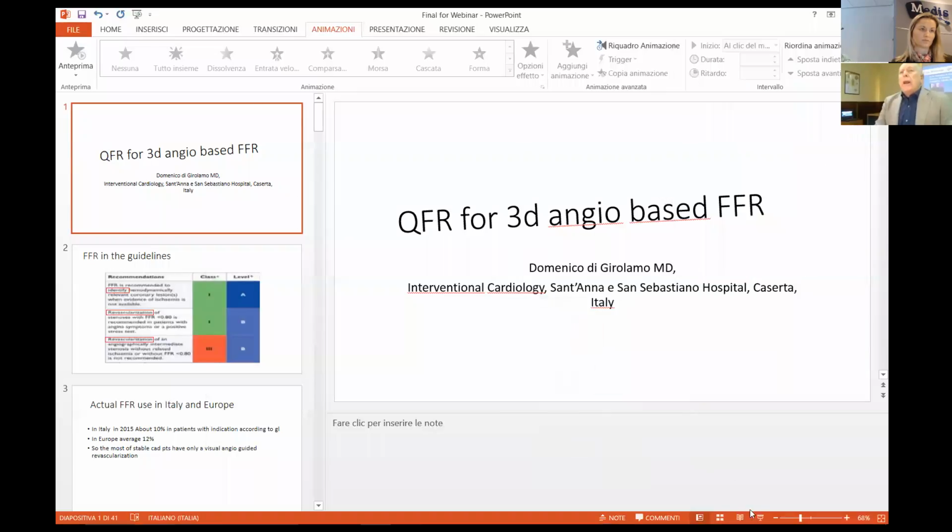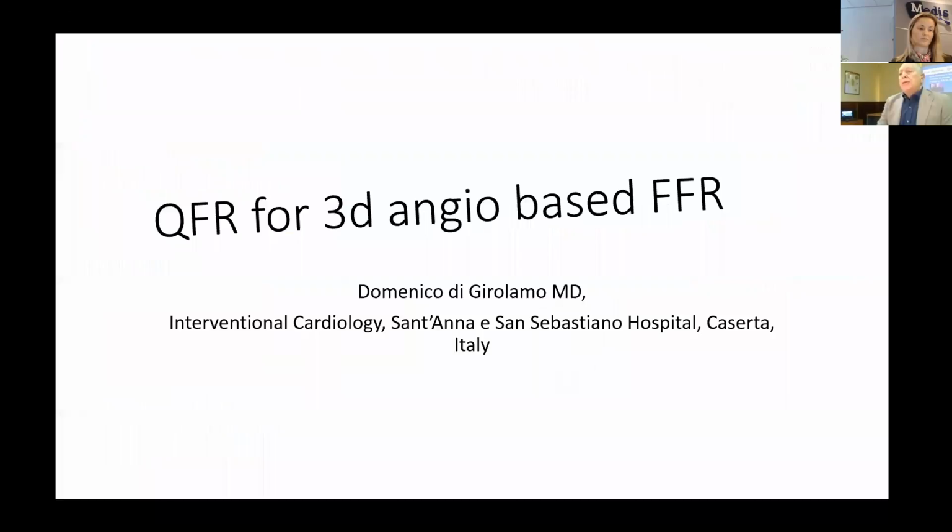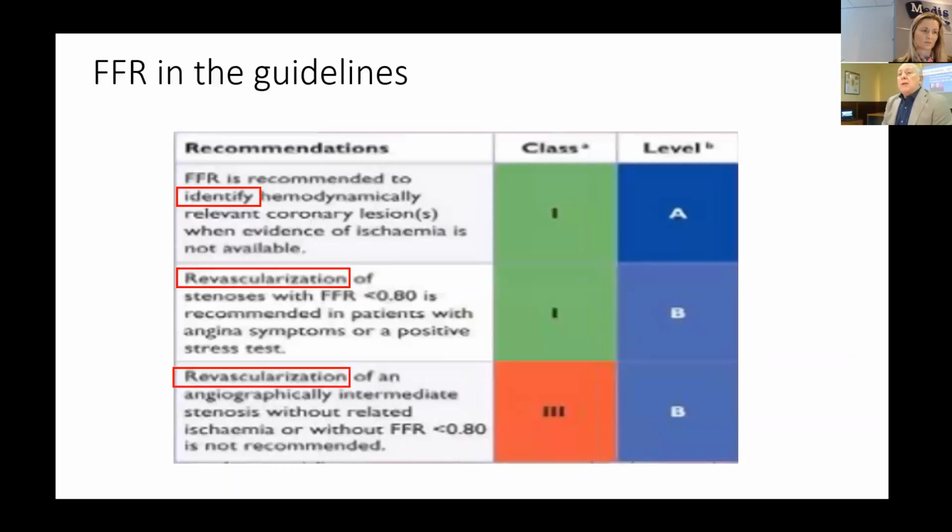And okay, I want to thank all the participants to this webinar, and I will show you the clinical use of QFR in some settings that are very important in functional evaluation of coronary artery stenosis.